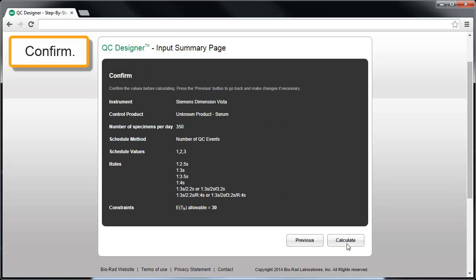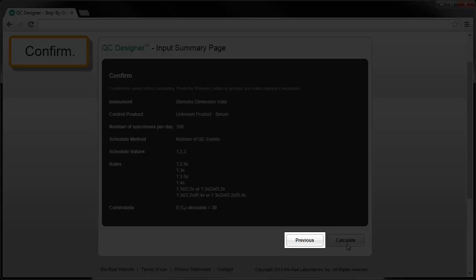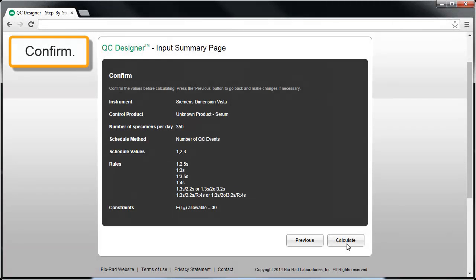Click Next. In the Confirmation screen, verify that what you entered is correct. If adjustments need to be made, use the Previous button to go to the desired screen to make the change. If you're satisfied, click Calculate. QC Designer will now look for all possible QC strategies that satisfy the performance requirements that have been specified.